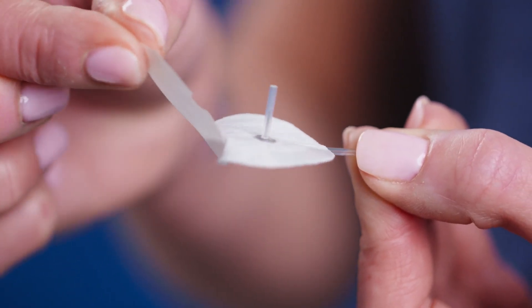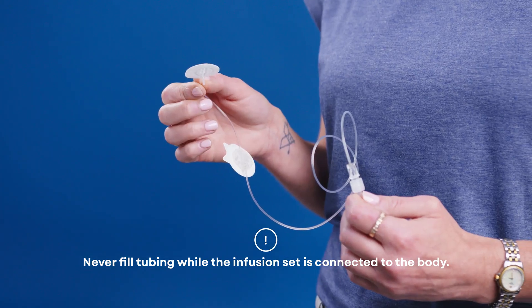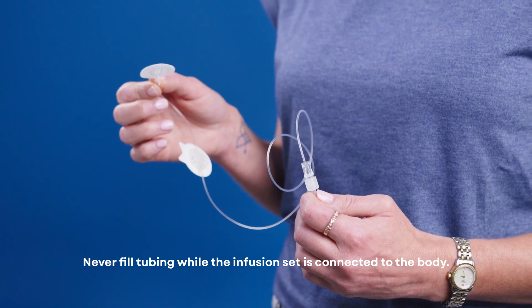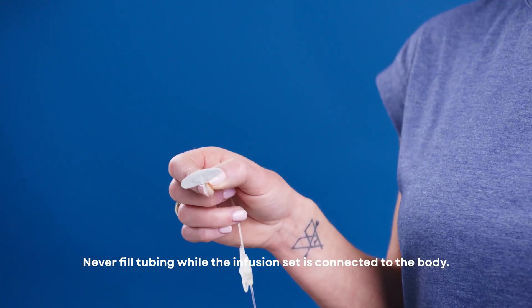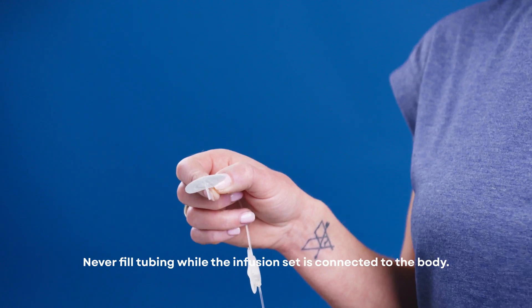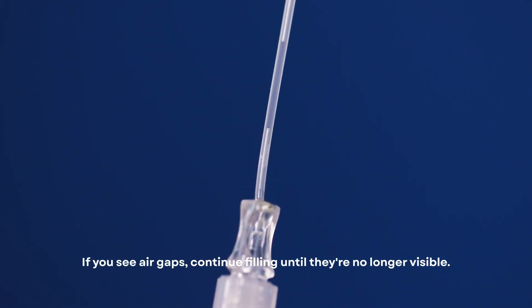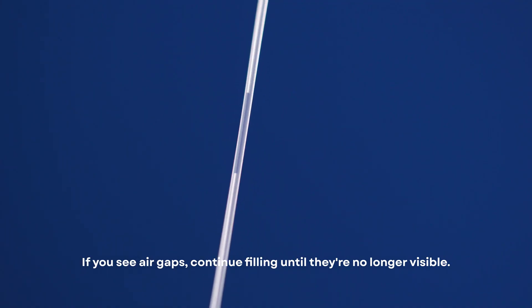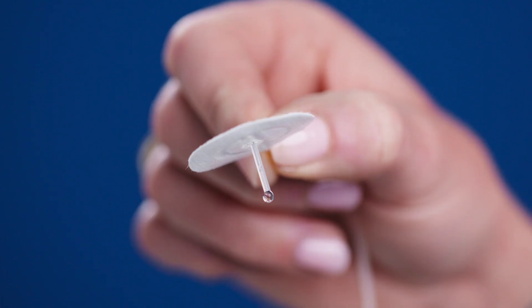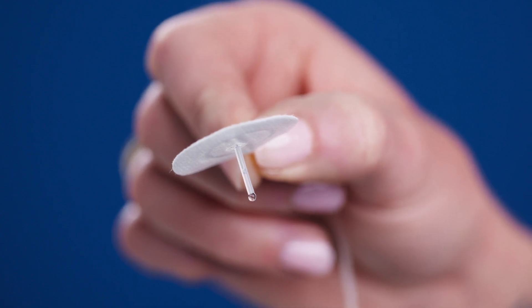Carefully remove the adhesive paper. Now you're ready to fill the tubing with insulin. Hold the pump with the cartridge connector or pigtail pointing up to push out the air bubbles. Point the infusion set needle downward to prevent insulin from falling onto the adhesive. Then check for air gaps in the tubing. If you see air gaps, continue filling until they are no longer visible. Finally, ensure you see drops of insulin at the end of the connector needle before proceeding.